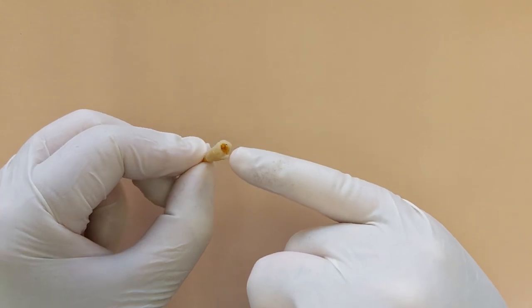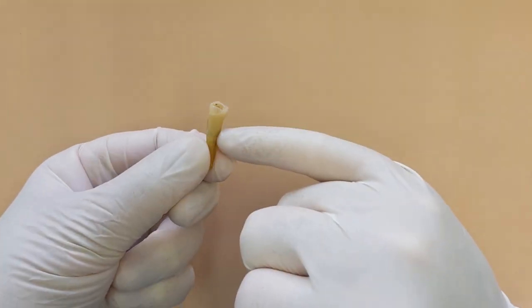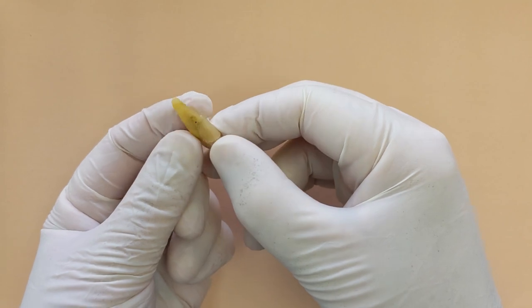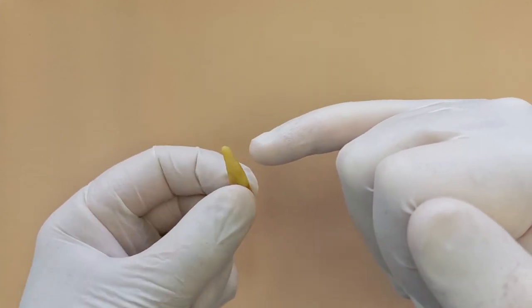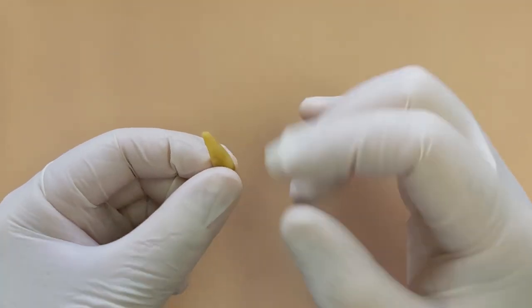As you can see, it's pretty worn down. The tip is worn away. It's also got a very big white filling. So I'm going to root canal this so you can actually see how we do that. You might be able to see a little bit through the side of the tooth, and you'll see the files emerge out the apex.